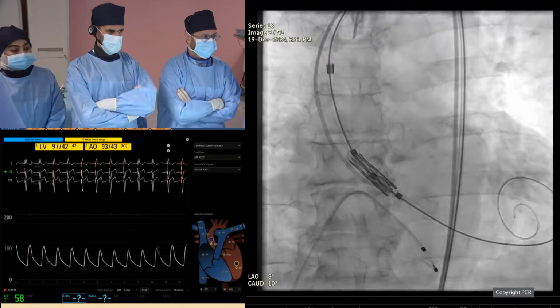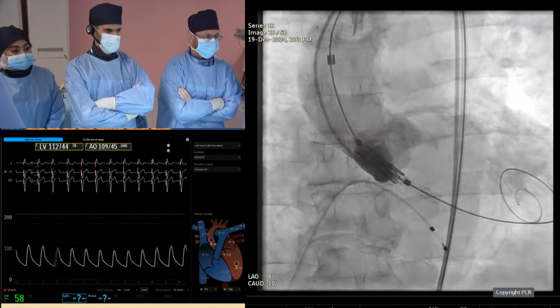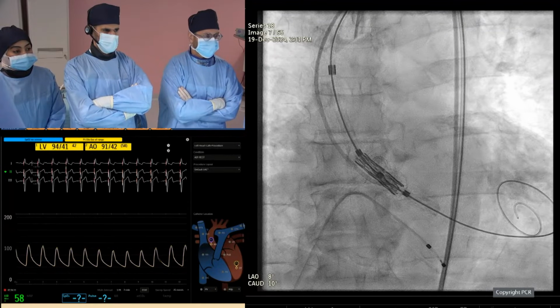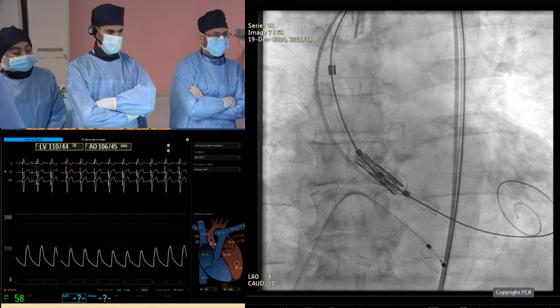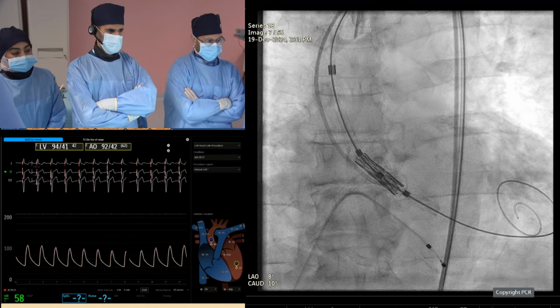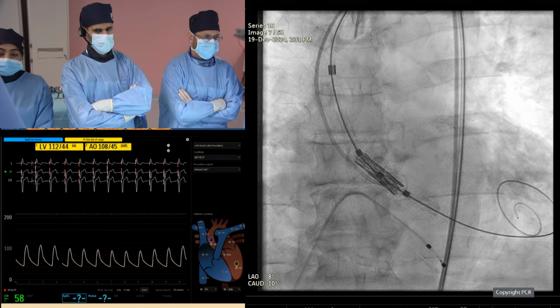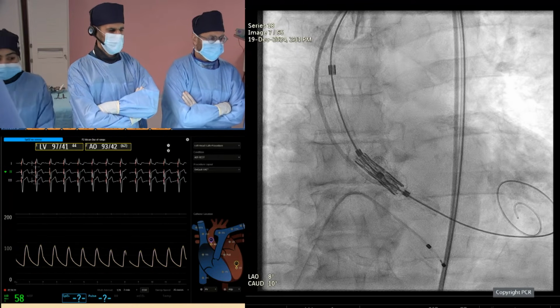So let's look at, there were two aspects that one sees here. I hope you're looking at the frame rather than the markers on the balloon, because we rarely are ever able to center this valve to the balloon markers. And my second aspect would be removal of the parallax from the valve frame at this point. So two aspects which are there, making sure that you are well co-aligned, as well as removal of the parallax from the valve frame. See what happens during balloon implantation?